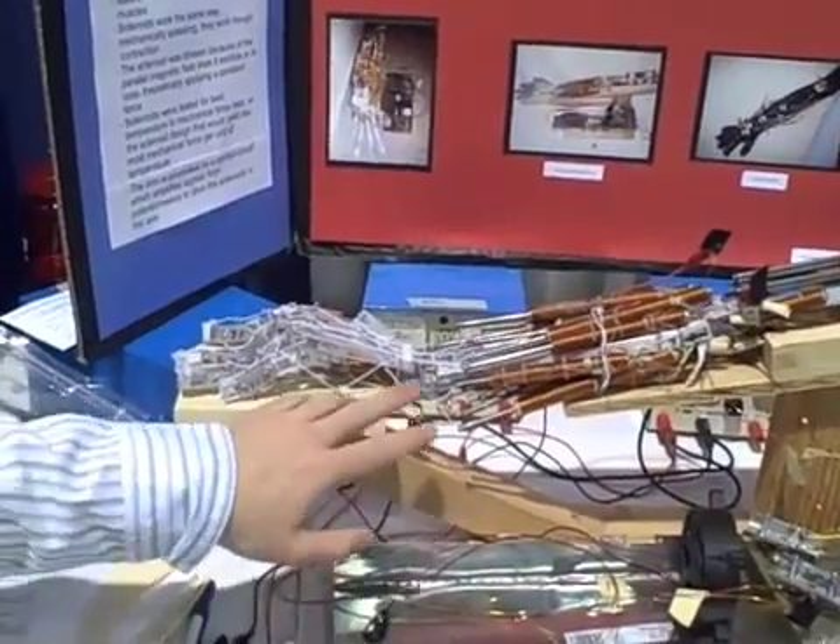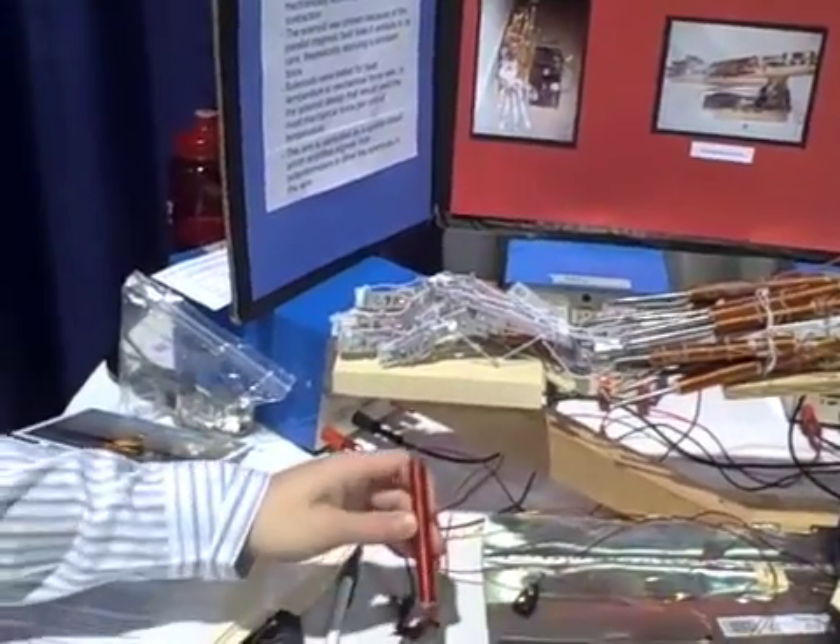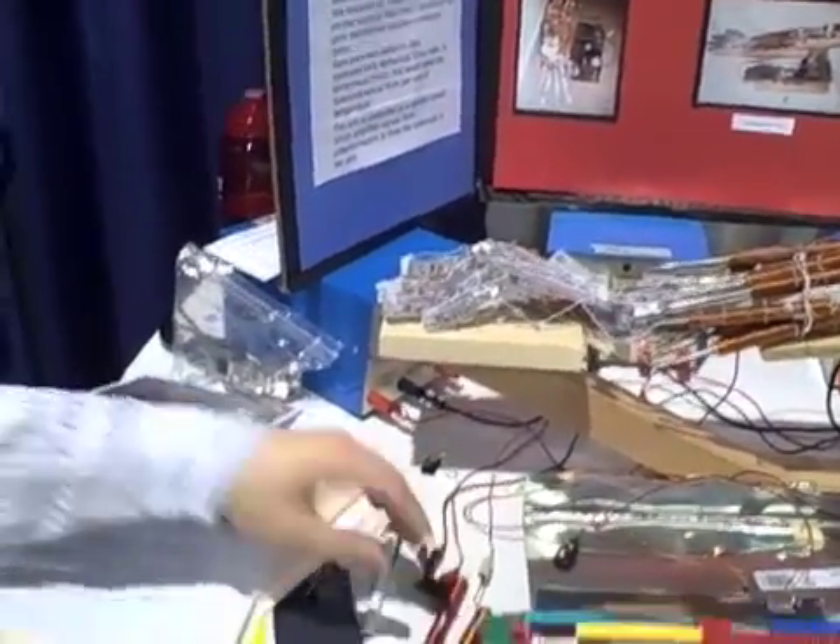Unfortunately, the solenoids I'm using right now are really inefficient. In the future, I'd want to use finer wire solenoids because they run at about one-eighth the power and generate the same mechanical force. So on the same amount of power, I'd be able to generate eight times the force, resulting in a much stronger Bionic Arm.